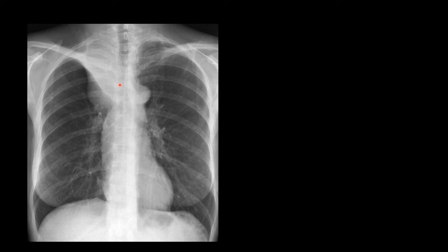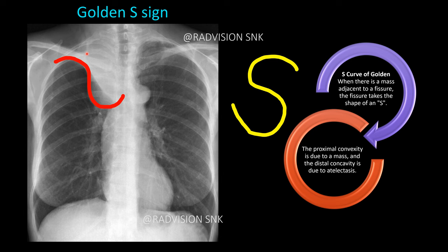Next case: there is homogeneous opacification of the right upper lobe limited by the horizontal fissure, but you can clearly see the medial margin is convex and the lateral margin is concave, resembling an S-shape. This is called the Golden S sign, typically seen in upper lobe masses or central lung masses causing obstruction and collapse of the upper lobes. The medial convexity is due to the mass and the lateral concavity is due to the collapse.